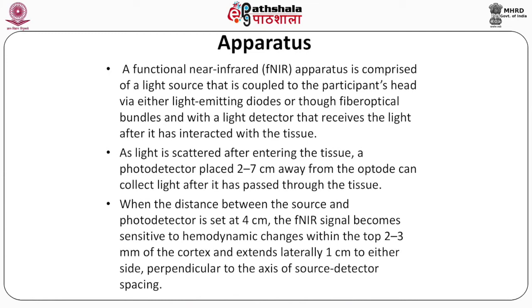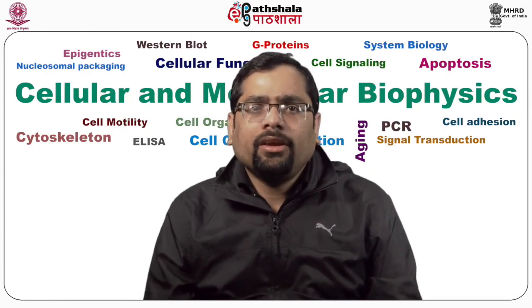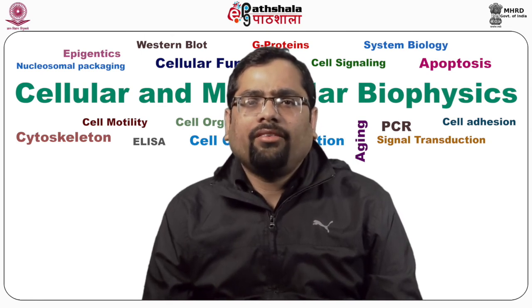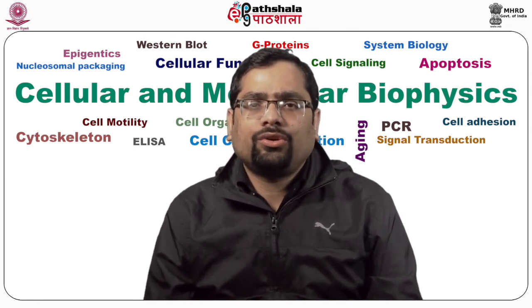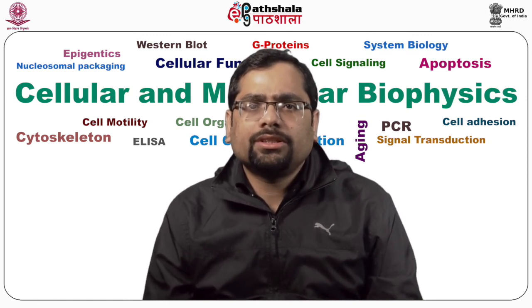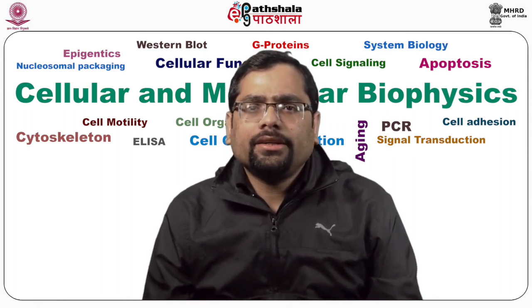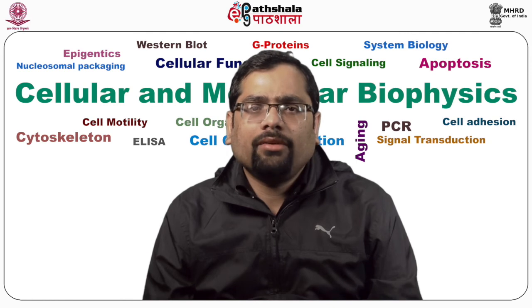Coming to the various fNIRS system types, we have several. A wide variety of available fNIRS instruments differ with respect to their system engineering, with combinations of light sources, detectors and instrument electronics that result in a balance in the information available for analysis, their safety and cost.